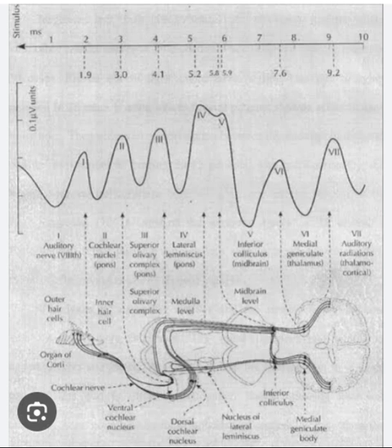The amplitude of wave 2 is relatively stable and less variable compared to wave I, making it a reliable component for waveform analysis. However, it is essential to consider that abnormalities in the cochlear nucleus or the ascending auditory pathway can affect the characteristics of wave 2.